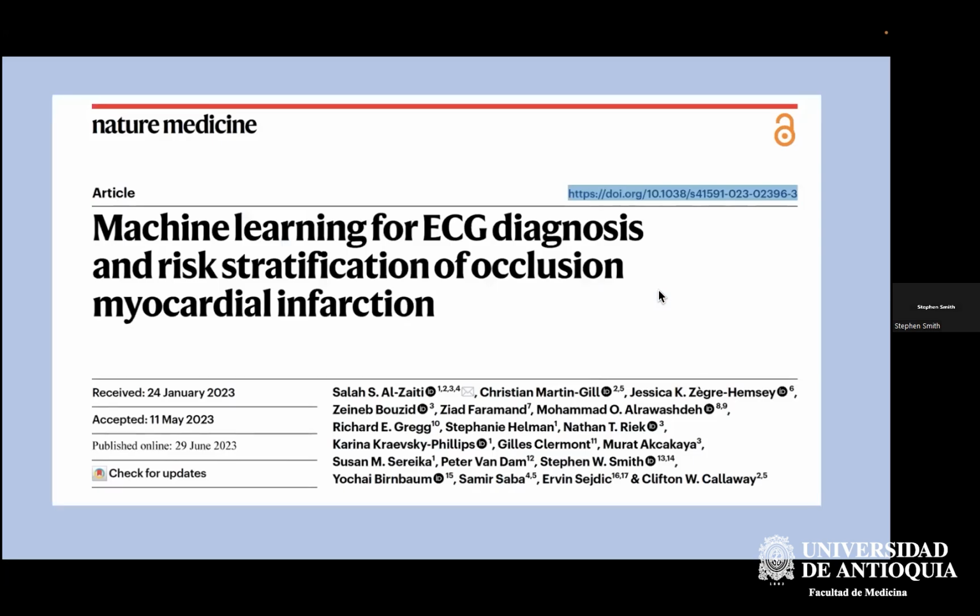AI can only analyze XML files. It cannot analyze JPEGs or PNGs. Well, these computer scientists at this conference said it's impossible. You cannot possibly digitize a JPEG or a PNG or a PDF into an XML file. Well, it turns out that there was a company who could do it.